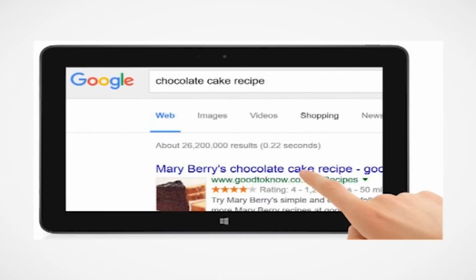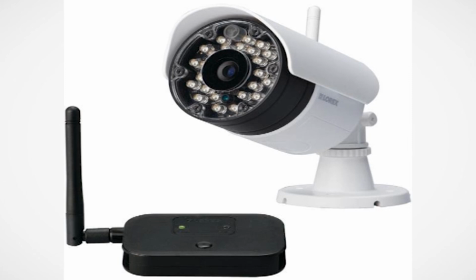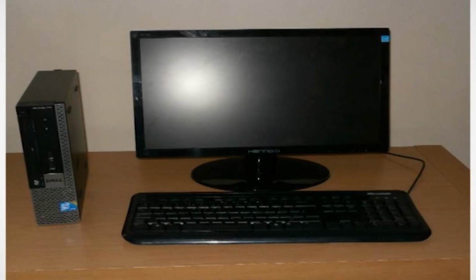Electronic devices. Electronic devices provide a high level of magnification, excellent contrast, and are useful for reading larger amounts of information. There are closed circuit television, handheld cameras, computer programs, and head-mounted systems that allow a variety of educational, recreational, and professional activities. Closed circuit television has a movable platform for book or paper, a video camera with a zoom lens, and a large screen video display. It sets up a complete system on a desktop.